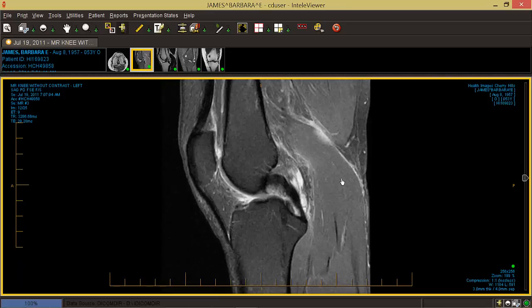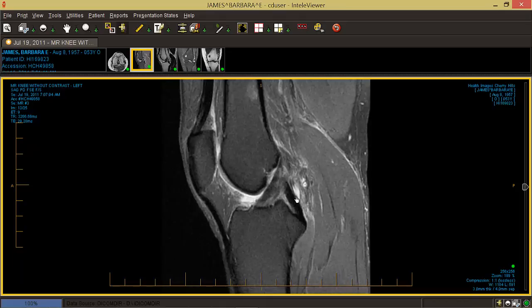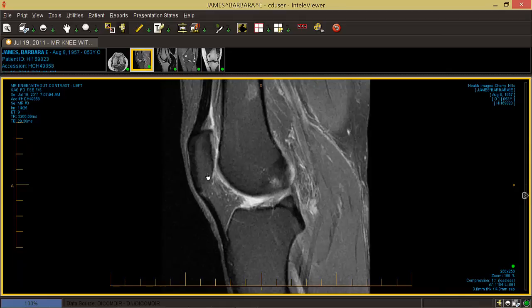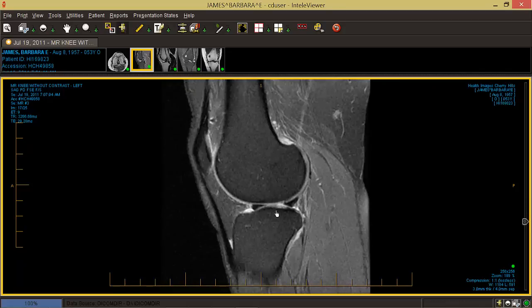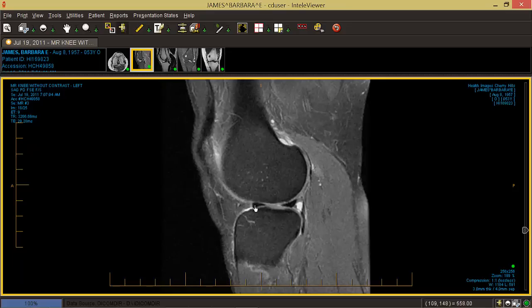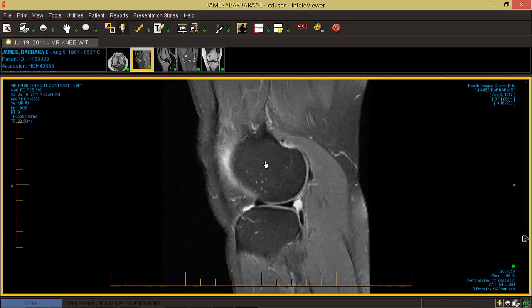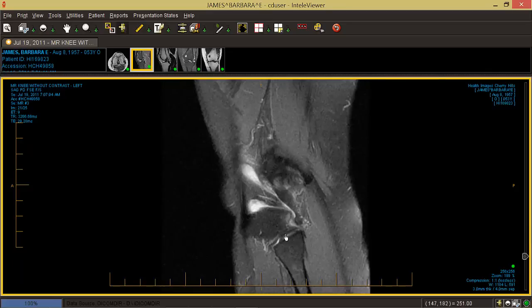As we go through the middle, you'll start to pick up the midline ligaments. You'll see the patella or kneecap up front, and the kneecap tendon. This is the PCL, or posterior cruciate ligament. Next you'll see the ACL, or anterior cruciate ligament, going at a 45-degree angle. You can see cartilage on the end of the bone — the light stuff. As we go over to the lateral side, we pick up the meniscus triangles again, the light cartilage, the dark bone area, and eventually we'll pick up the fibula bone.